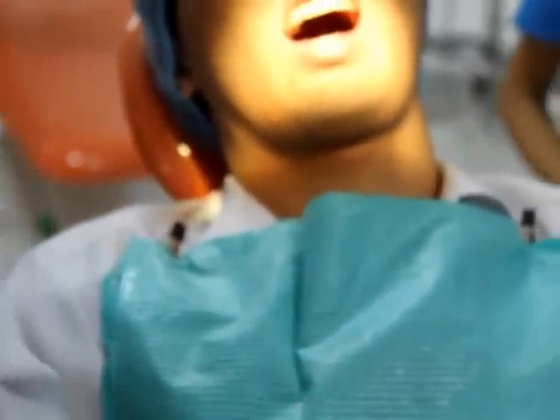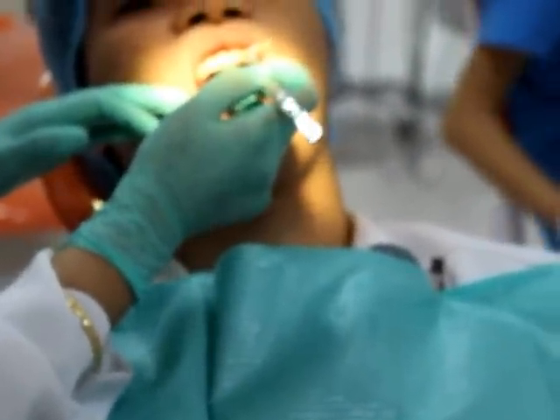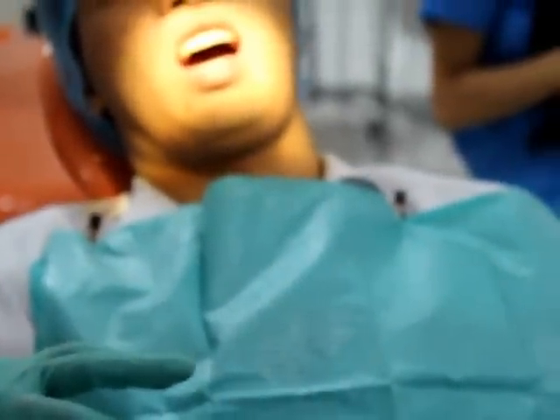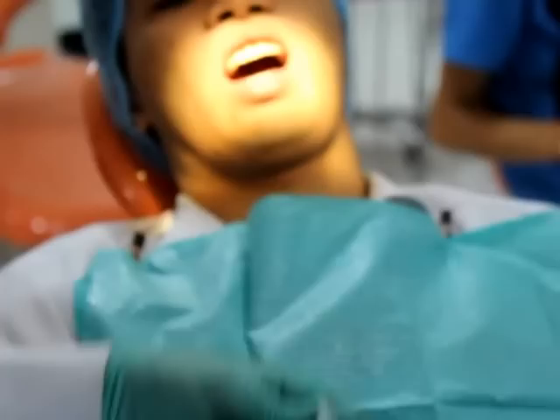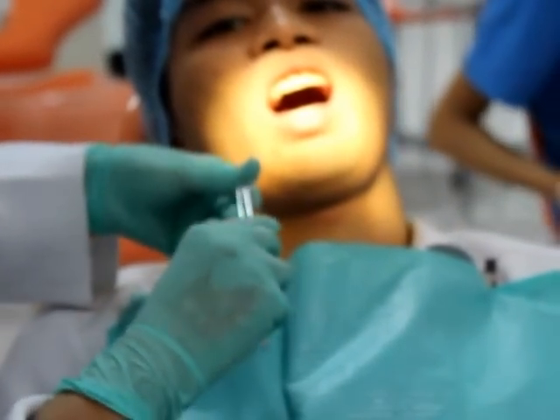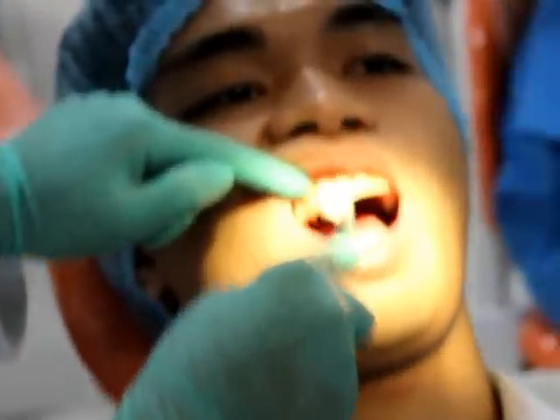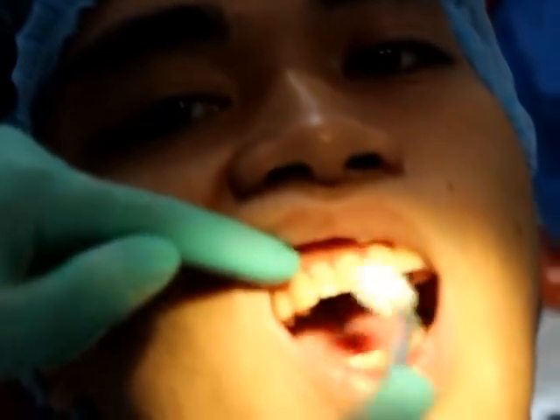Okay? Can you see, after the patient felt it, I have to remove the stimulus and time again. So you do it also on the other tooth and finally on the offending tooth and tell me the interpretation. Since the patient had 1, 1, 1, 1, the tooth is normal and it is vital. Then after that, you have to clean the tooth. If there's gutta-percha here, just remove it. It can be removed easily because you have placed Vaseline.